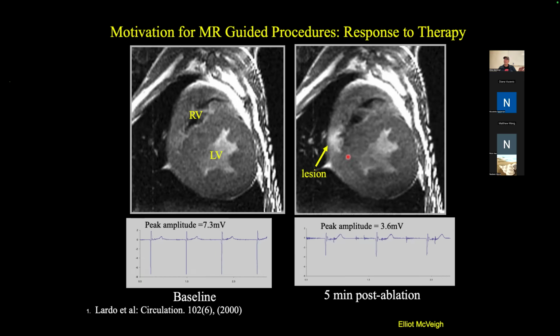So if you are in AFib, or heaven forbid, you have really long bouts of ventricular arrhythmia, the clinician will go in under fluoroscopic guidance, usually with a CT on the computer, and then they'll map your electrical activation with these electrodes and find the nidus of the abnormal behavior and then put an RF electrode there and burn it. And so you put it up to 47 degrees for a couple of minutes, and that tissue essentially gets burnt or dies. And then ideally, the abnormal electrical activity goes away.